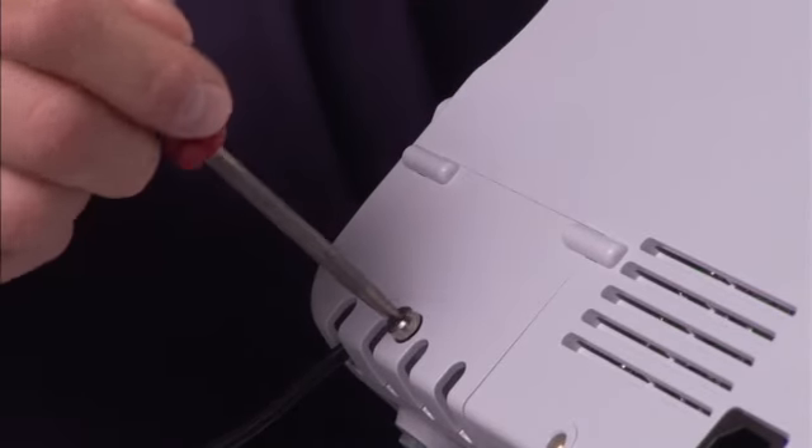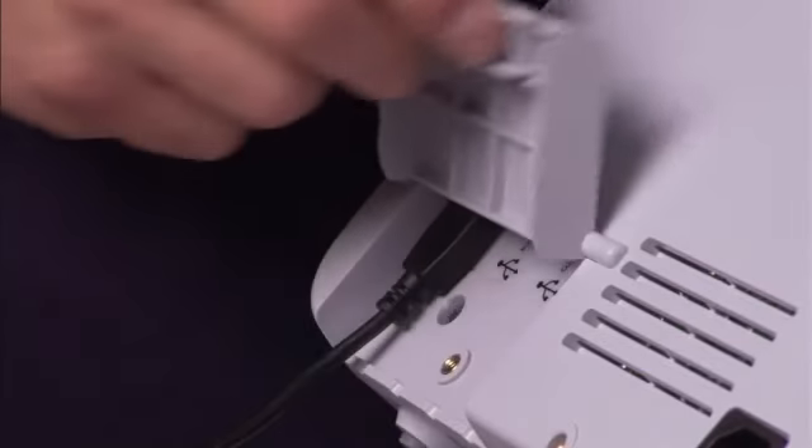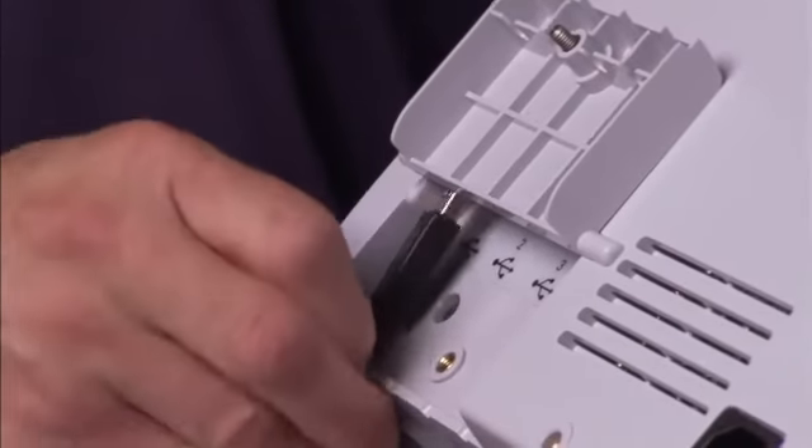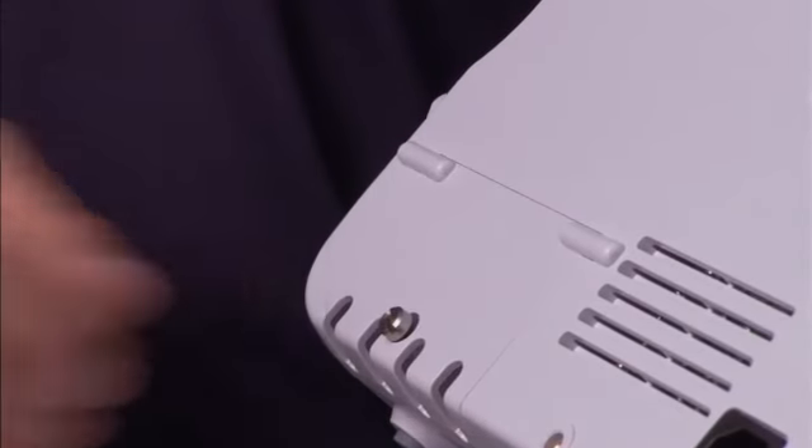To detach an accessory, loosen the screw on the USB door and open it. Detach the accessory's USB cable from the USB port on the monitor. Close the door and tighten the screw.